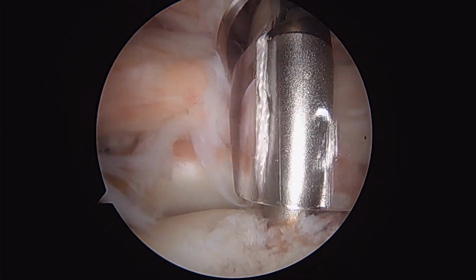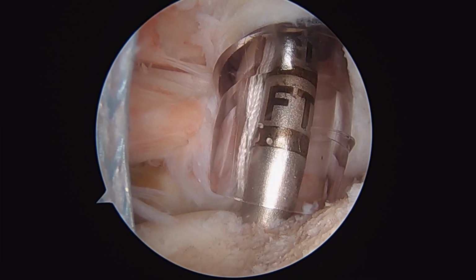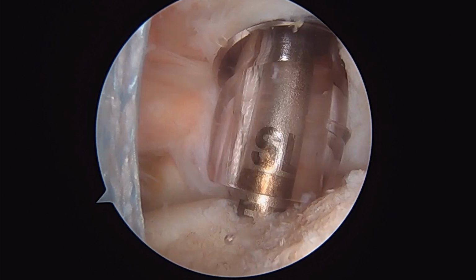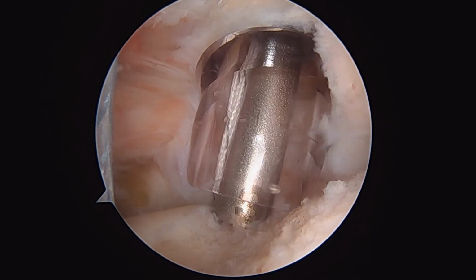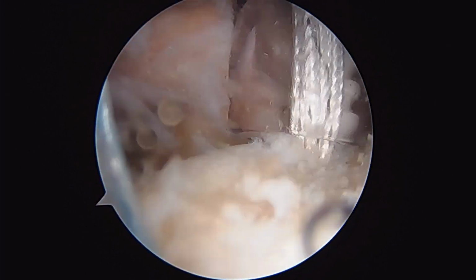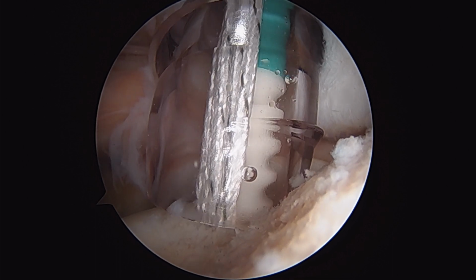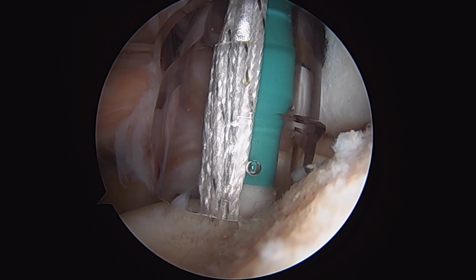In order to repair the tendon back to bone, sutures must be inserted into the bone itself. Various different techniques can be used for this. Depicted in this video, an instrument is inserted into the bone to create a tunnel to allow for a bioabsorbable plastic screw to be inserted. Suture anchor or bioabsorbable screw is now inserted into the bone, effectively trapping the sutures into position.